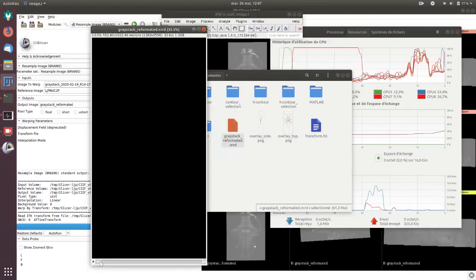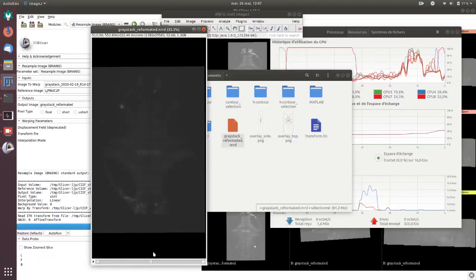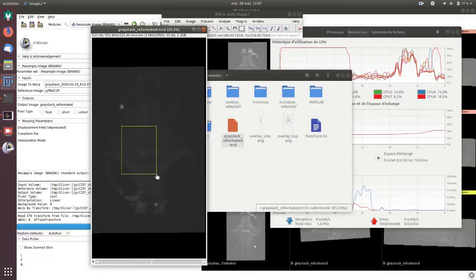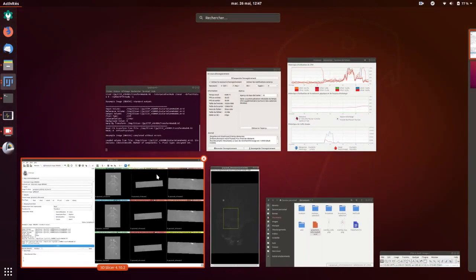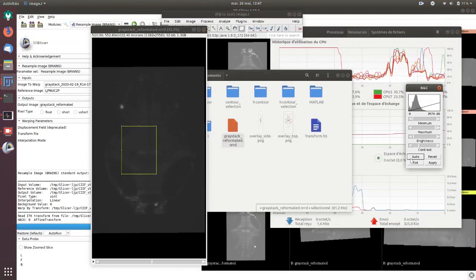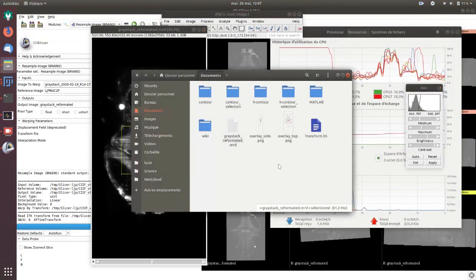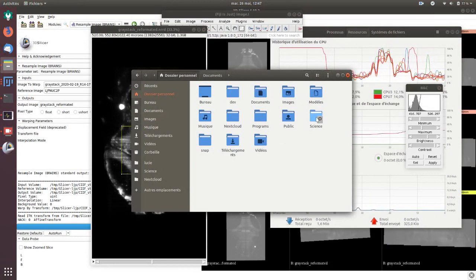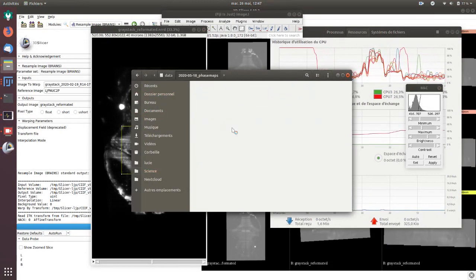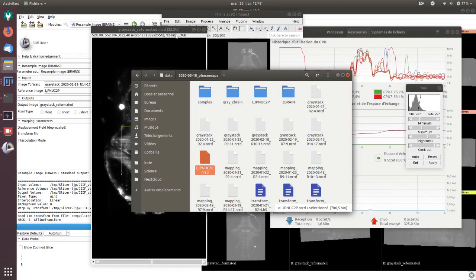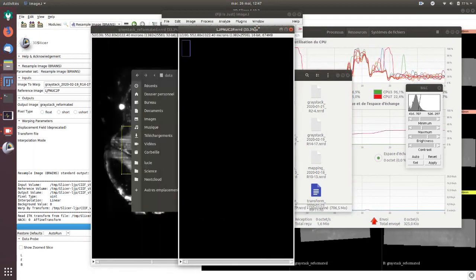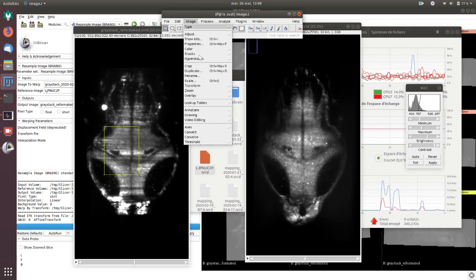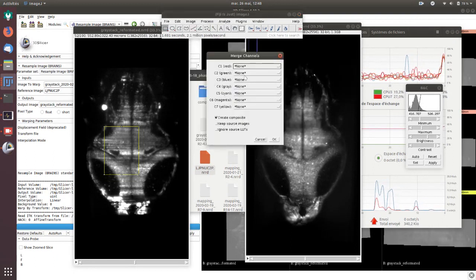Okay, so here it's open. I can adjust the contrast in ImageJ by clicking auto. I also can open my reference brain which is stored, for example, here. Open both in ImageJ, image color, match channel.